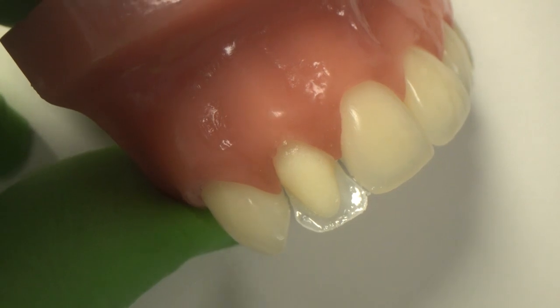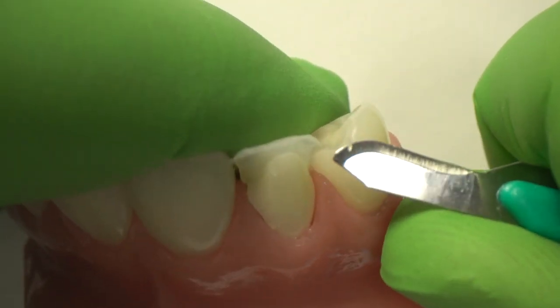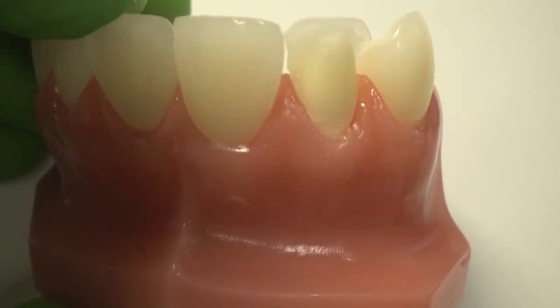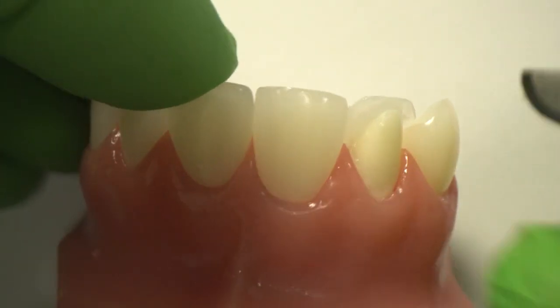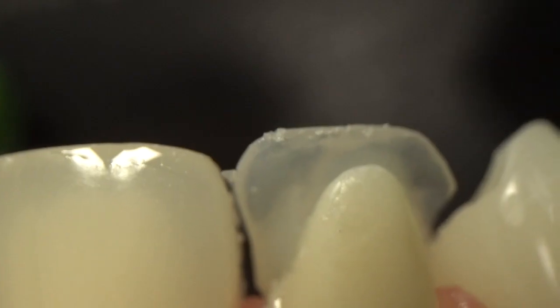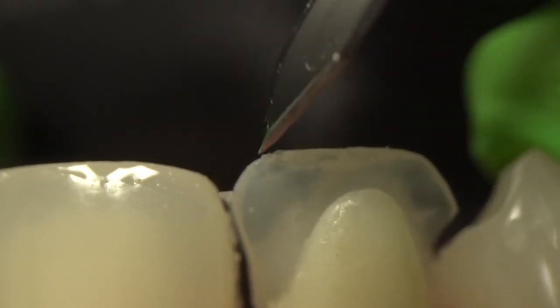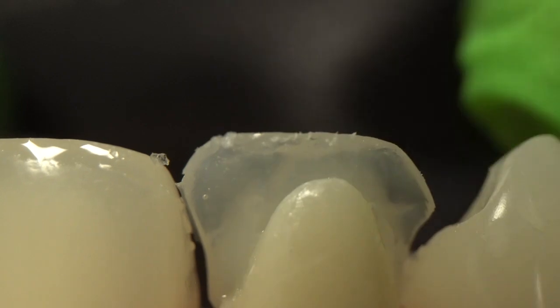There's a little bit here on my canine. And if you have any flash — like I have a little bit here on the mesial — let me put on my contraster so you can see that a little better. Then I can come in with my blade and trim away any excess, just like that.